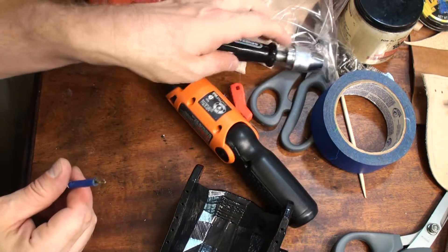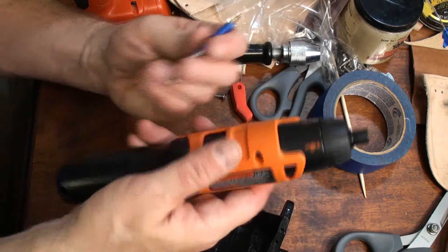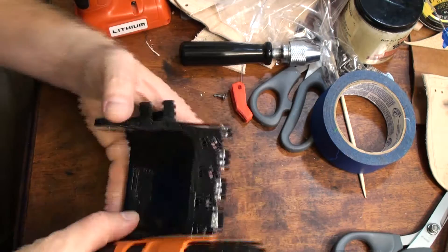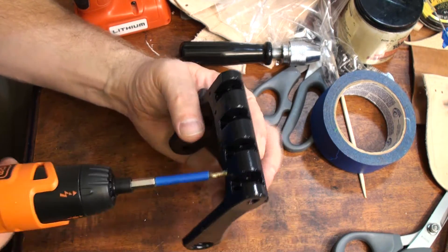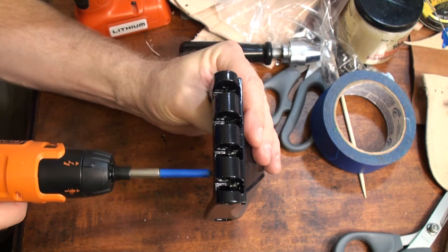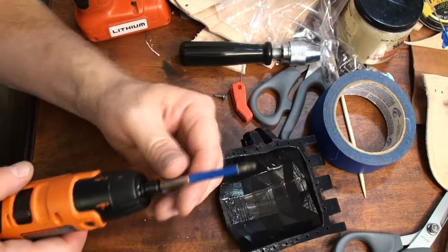We have a couple of other options too. Because I've got a hex bit, this one will actually go in an electric screwdriver, so I can do it with that as well. And because of the tape, I don't have to worry so much about over-drilling. That worked great.